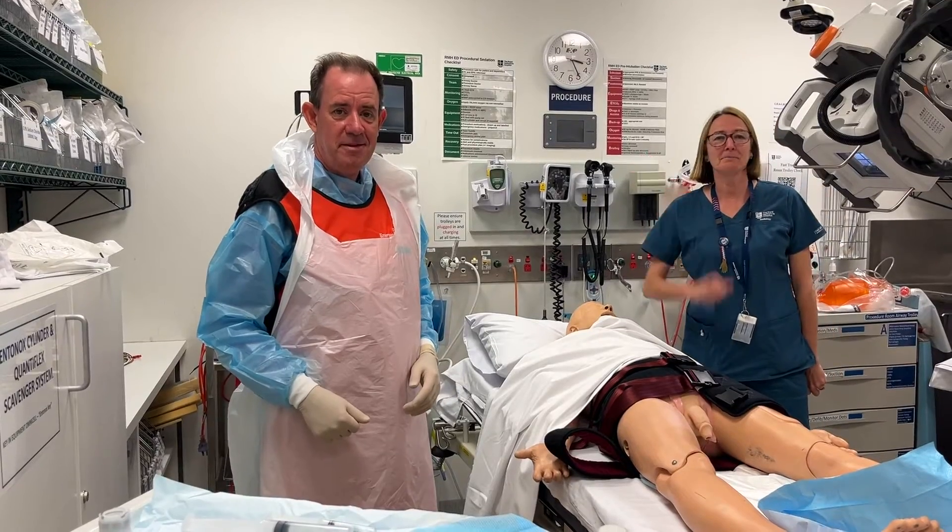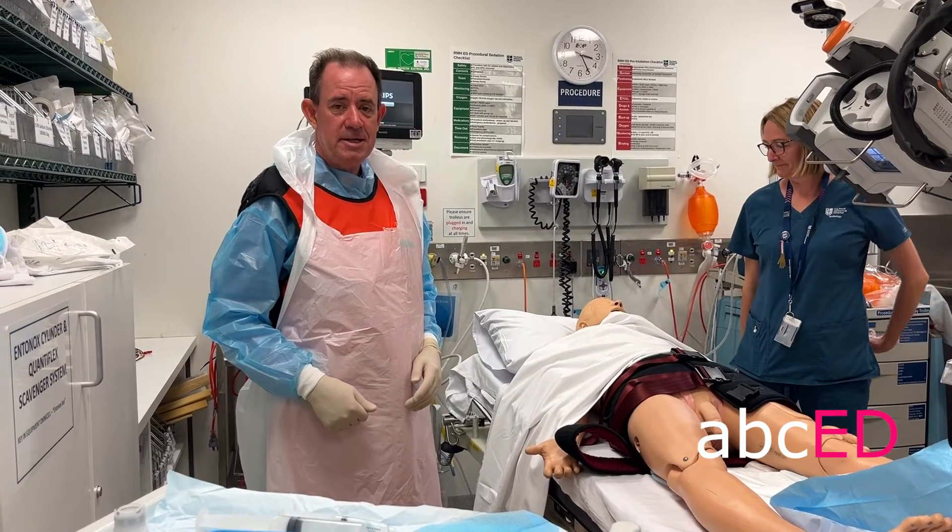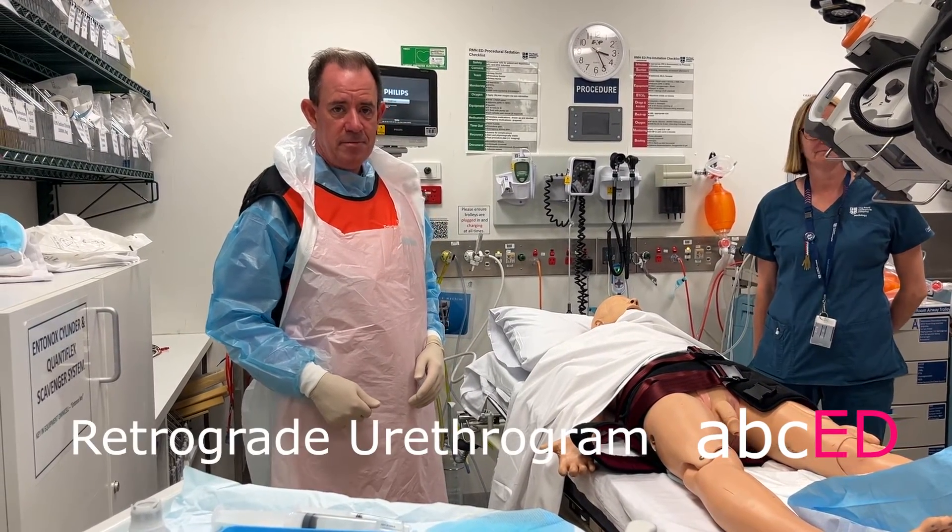Hi, it's Jonathan. Hi, it's Kirsten. Welcome to abcED. Today we're going to do a retrograde urethrogram, and we do this in patients who are concerned for traumatic rupture of the urethra.